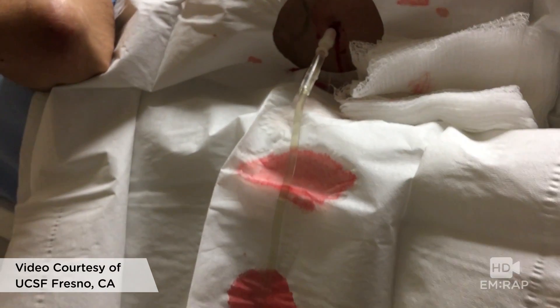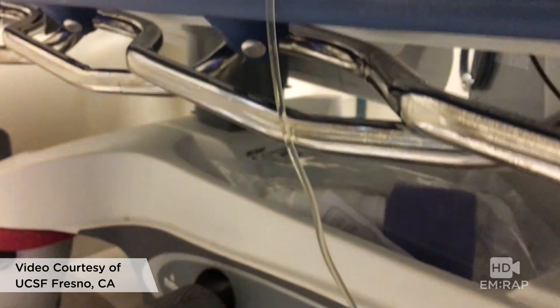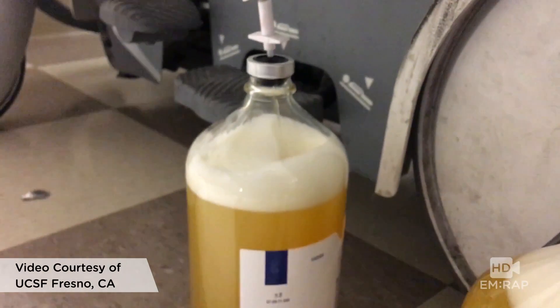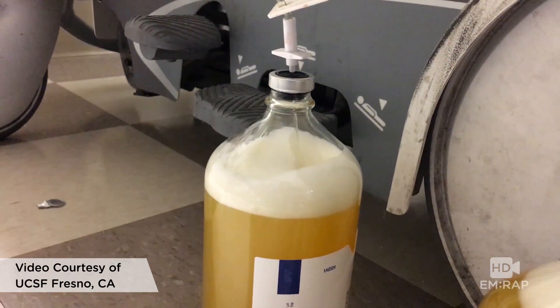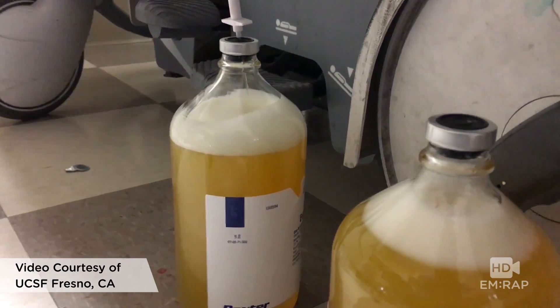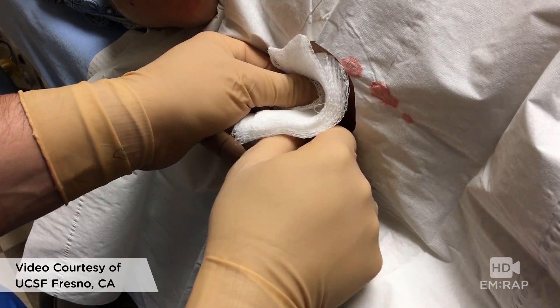Keep an extra pair of sterile gloves nearby in case you need to readjust the catheter. This is the typical appearance of ascites fluid: straw-colored, slightly frothy. Let this drain and fill up the bottle. When it's time to switch to a new bottle, clamp the tubing and insert it into the next bottle top — when you unclamp it, the vacuum will draw that fluid right in.